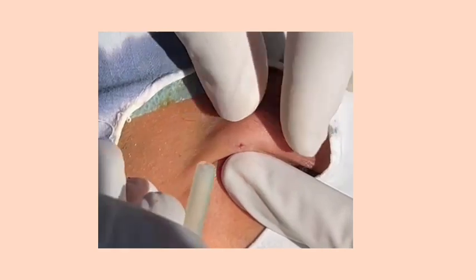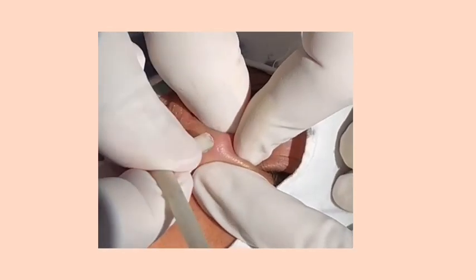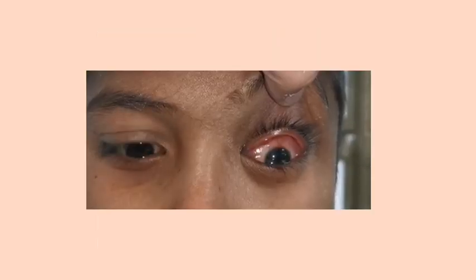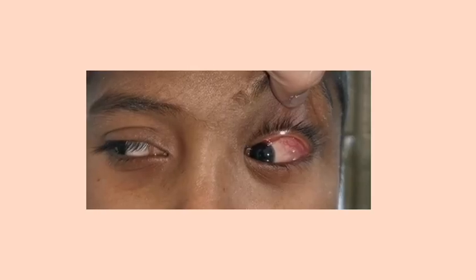An opening was made using a needle and pus was drained using suction. After 1 week, extraocular movements had come back.